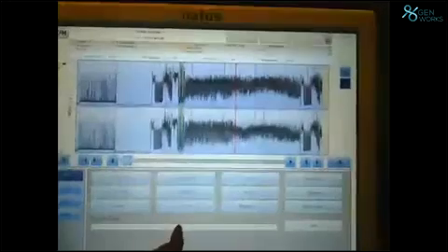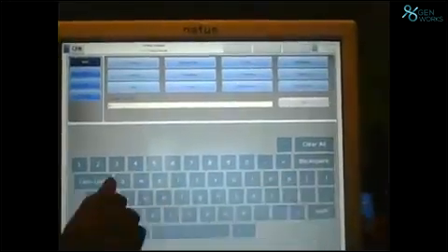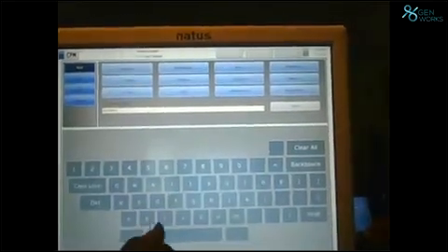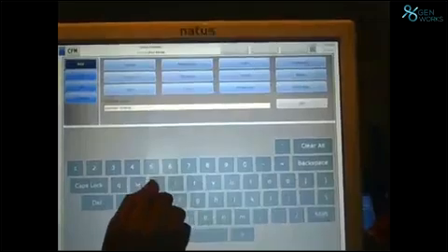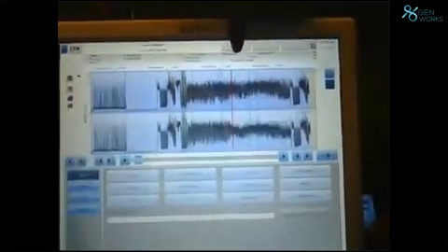See here, the technician is showing. Suppose pamper change. Okay, pamper change. Just go to add. See here, the words pamper change have come near the line.